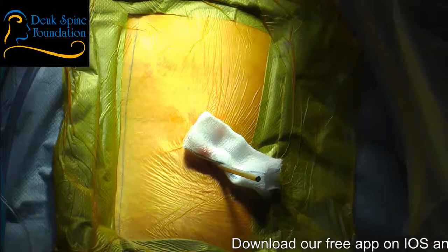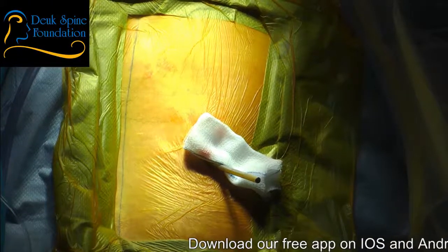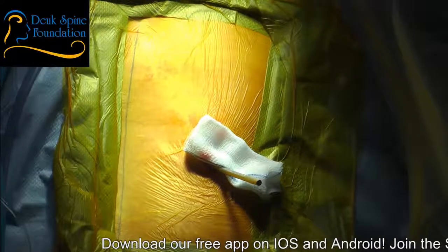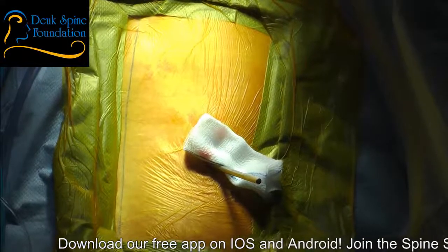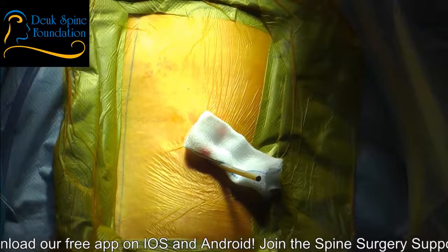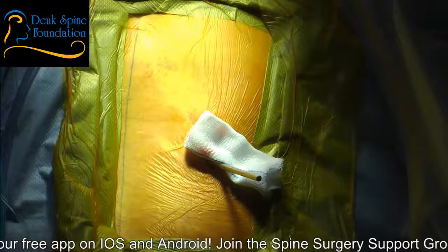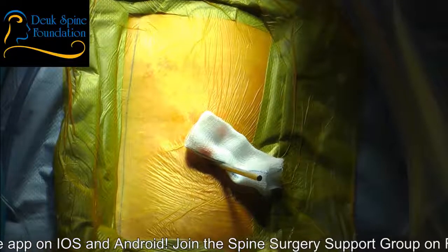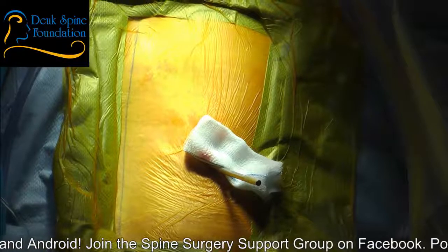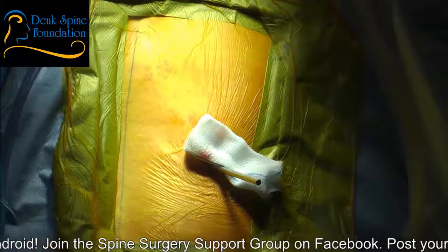I start higher up on the back and I aim more down to try to navigate through that collapsed tight foramen. But sometimes all the scar tissue, as this patient has a pars defect, which is really a fracture through the pars, probably on both sides. I don't remember what he's got, but there's all this scar tissue, bone, all this stuff that isn't normally there.